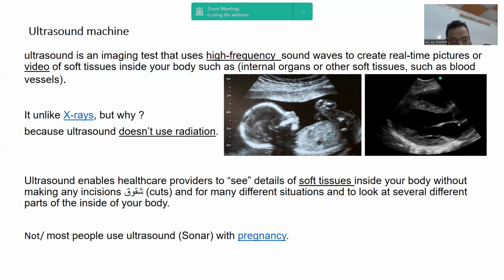Ultrasound enables healthcare providers to see details of soft tissues inside your body without making any incisions, and that means without any blood, without any bleeding, and for many different situations, and to look at several different parts of the inside of your body.